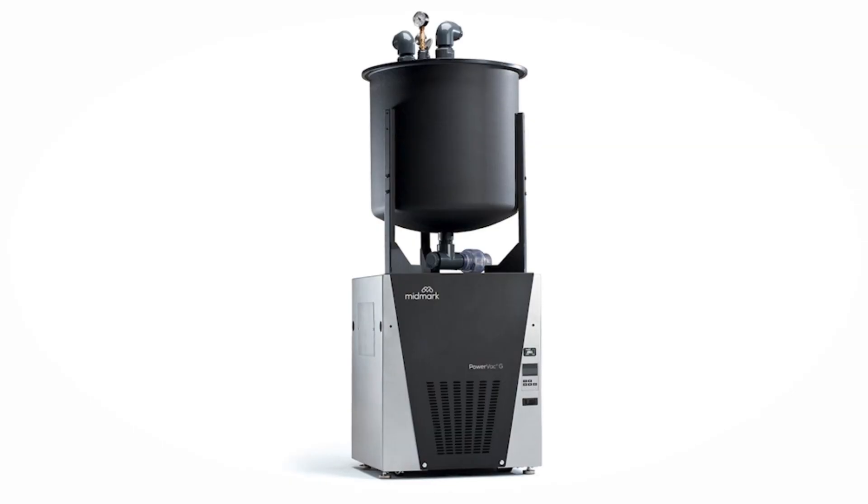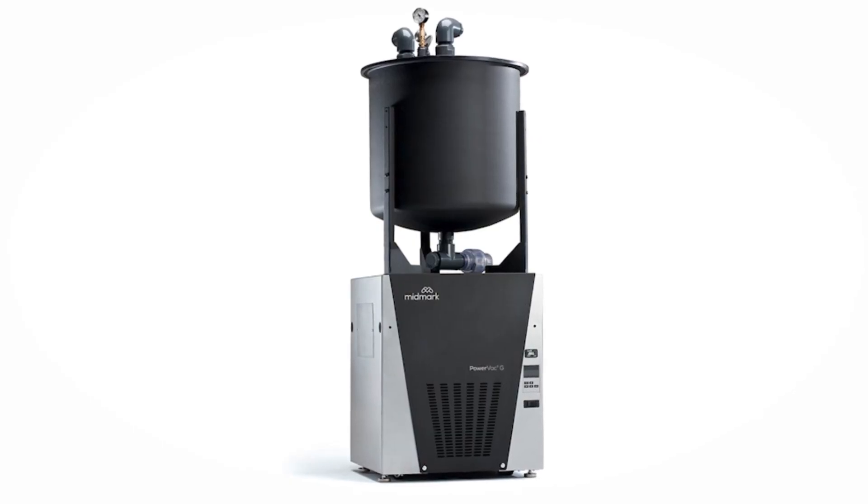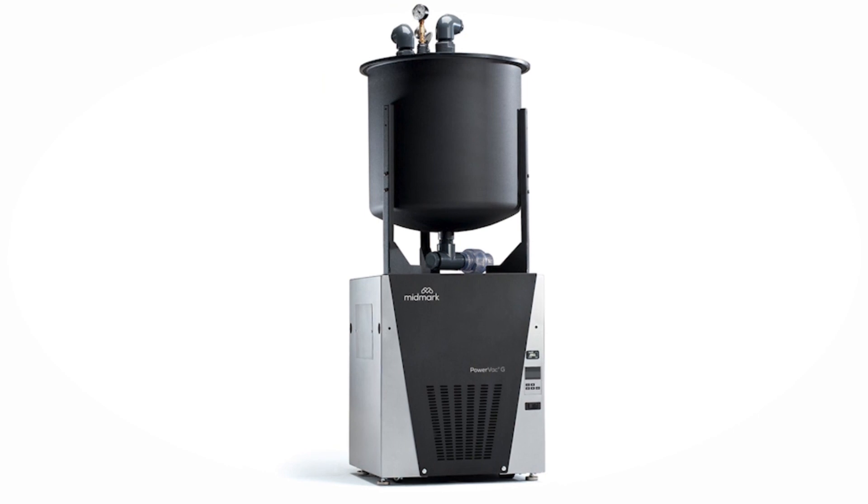Today we're going to talk about suction and why choosing a dental vacuum with the right kind of pump matters. From the mechanical room to the tools in your operatory, your practice is full of technology that functions to keep you working. You count on it every day, but do you give much thought to how it works? Even if the equipment seems to be doing its job, understanding what works best and why can help you make effective choices to reduce downtime in your practice.